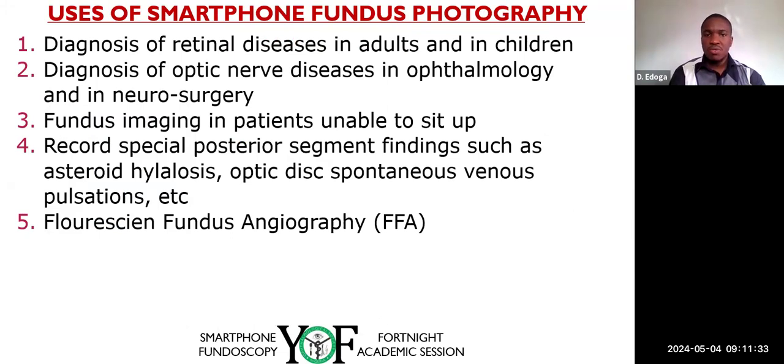There has been a study that was one of the best studies in West Africa in neurosurgery. So the doctor in question consulted me and I assisted him to get the device that he used. He used a PIC. A PIC is one of the adapters that you can clip on. It's a clip-on adapter to a phone. He used it just to image the optic nerve head in neuro-ophthalmic cases, and it was a wonderful study. So we can use it for that purpose.